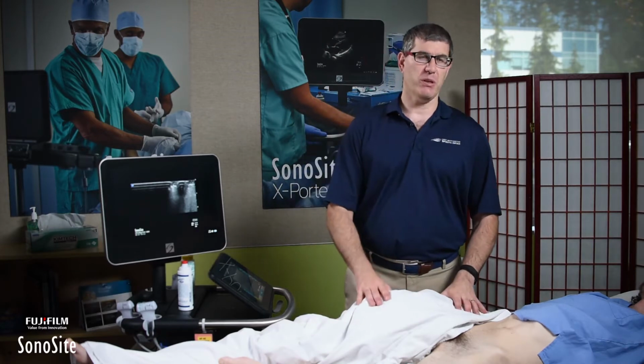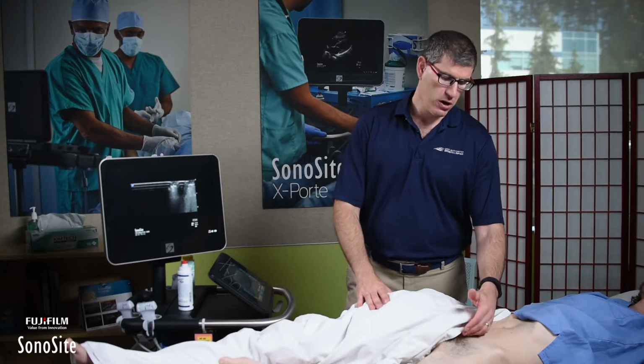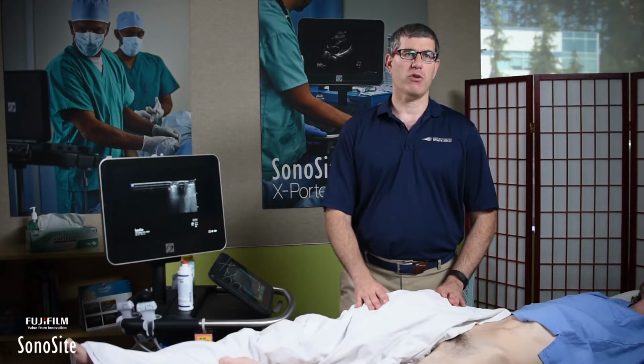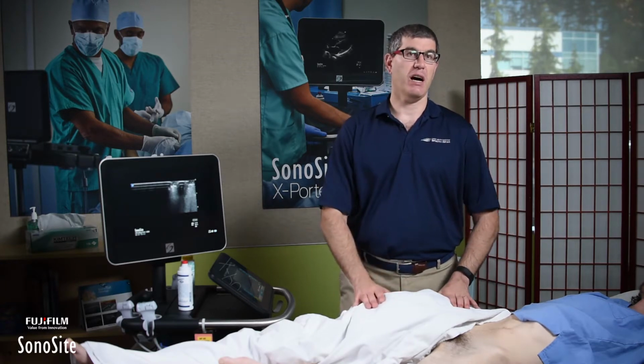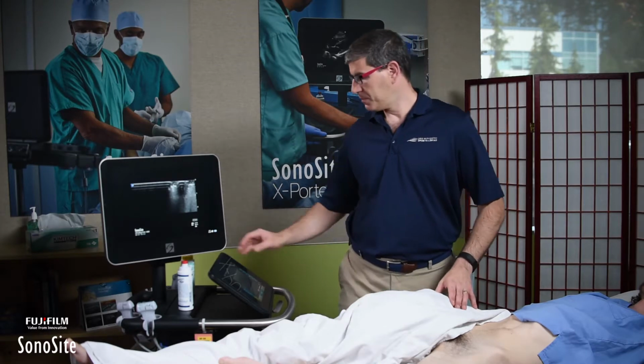In terms of exposing the patient appropriately, you're going to want to make sure that you can see the rectus abdominis musculature, the pubic tubercle, and the inner thigh. We recommend having the inner thigh positioned into the FABER position: flexion, abduction, and external rotation.